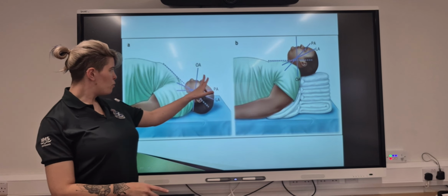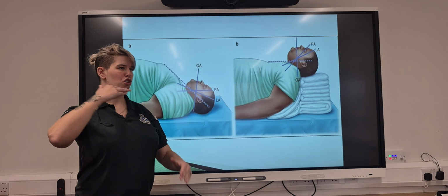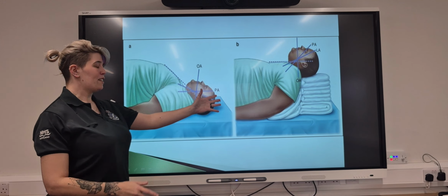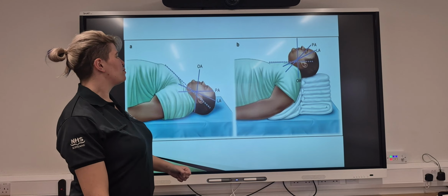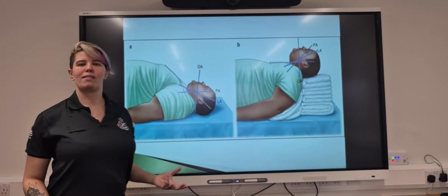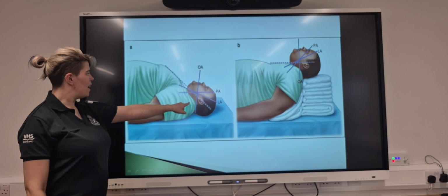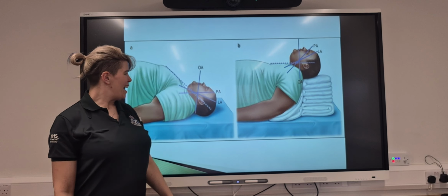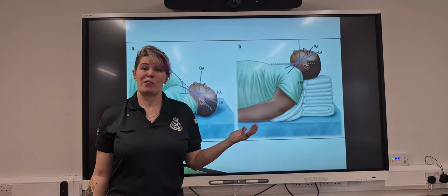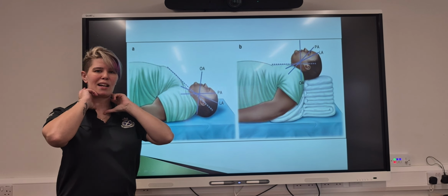So we speak about ear to sternal notch, this sort of line here. And I mean, you can see this looks quite extreme. This is more important for someone who's trying to intubate, so insert a tube, because trust me, you put your laryngoscope in that, you're not going to see anything. It's going to be really, really difficult to see the anatomy there.